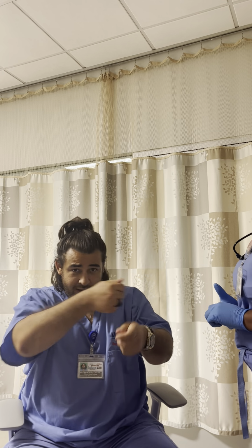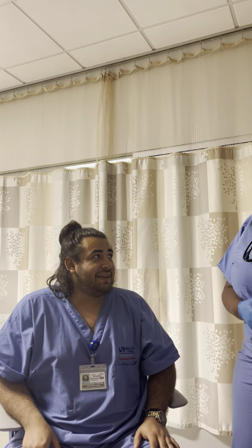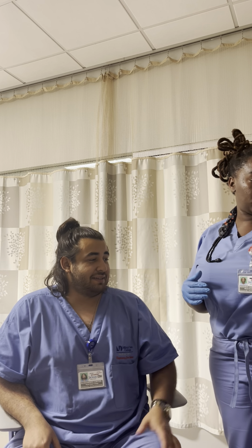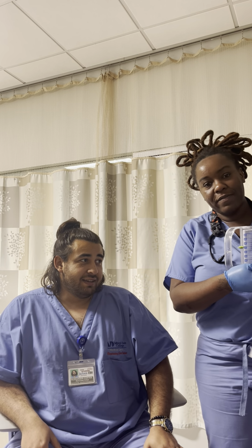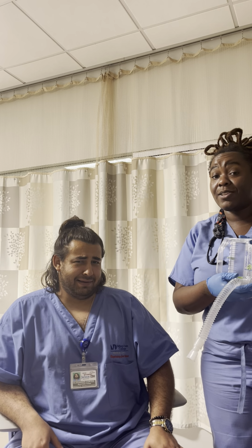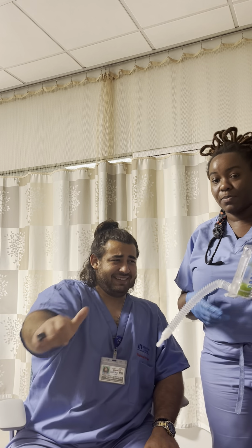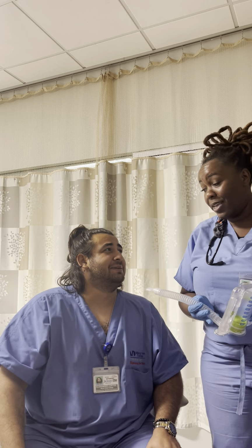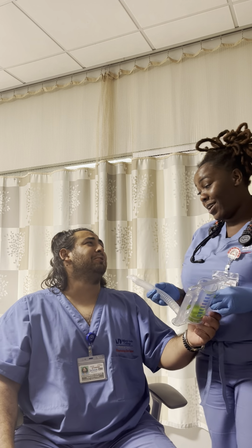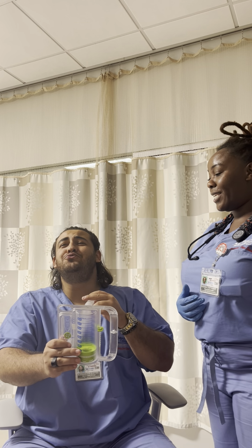All right. So now that we're going to boost it up to about 25 to see if he can handle this. Just to challenge them, we want that lung to expand, okay? If you can, okay? Yeah. Hold it upright. Make a tight seal.